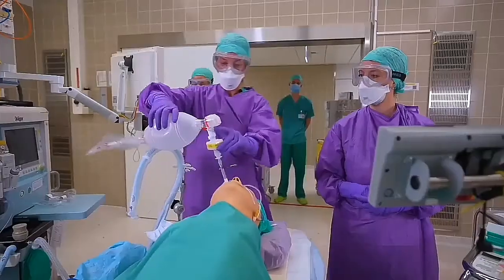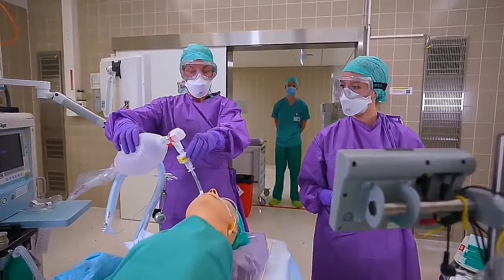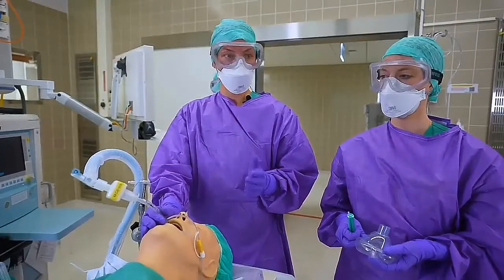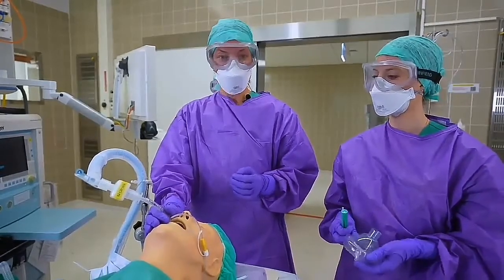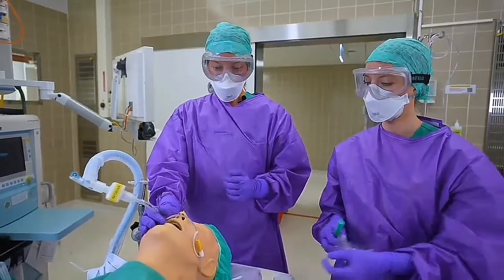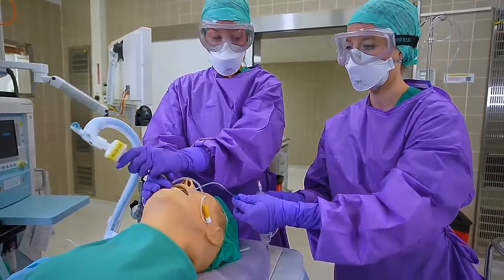We are saving our transport ventilators for use in the ICU, and hence currently we are utilizing bag valve masking for transportation of ICU patients. It is important to avoid coughing when you extubate the patient. Here, IV lidocaine or remifentanil come in handy. When you extubate, you're not utilizing positive pressure, but rather you're deflating the cuff and pulling the tube.